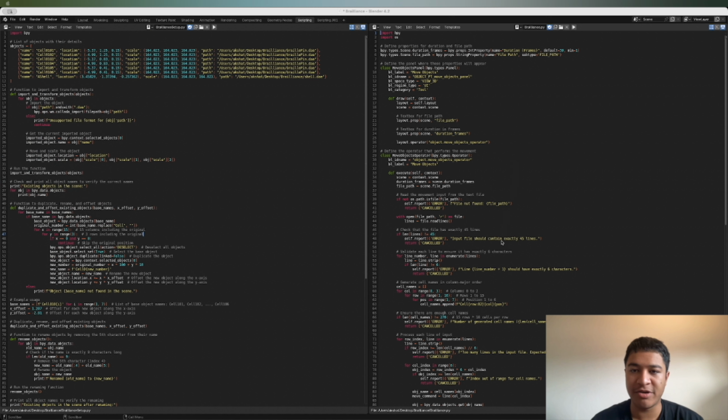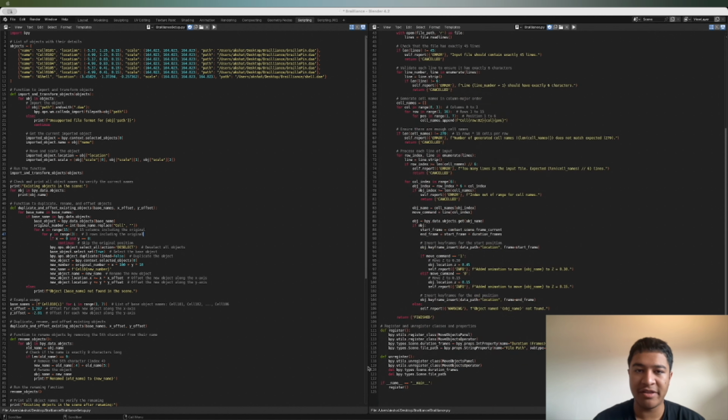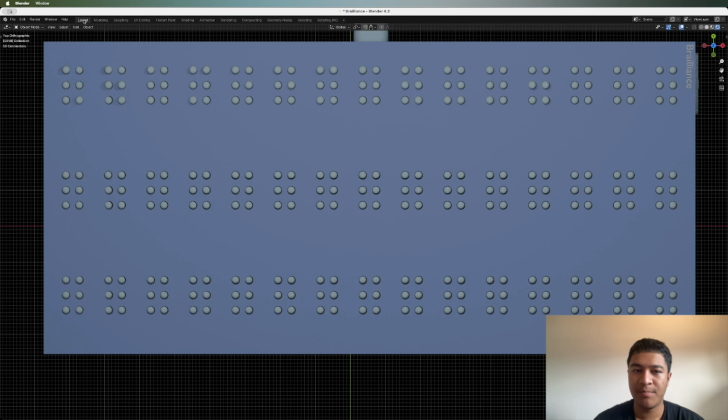The right Blender window showcases the Braille board regeneration program, which enables a user to input a TXT file with rows of 6-bit Braille characters and animates the pins by moving them up vertically if the corresponding bit is a 1. The 4x8-inch board is portable, has a power button, and also has a refresh button to generate the next set of 45 characters. The Braille board follows standard Grade 1 Braille conventions, which provides each character a Braille symbol.